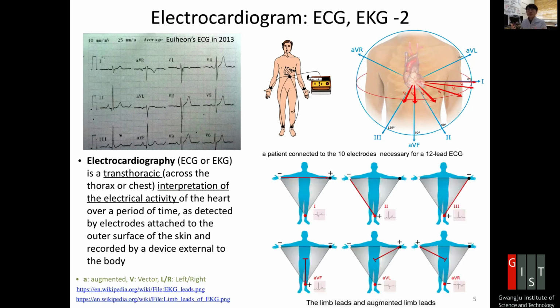So how do we visualize this three-dimensional electrical vector with these 12 electrode leads? A very simple way: we have these two arms. By the way, you have to see these as if the patients are looking at you. So this is the left part. You can consider the two arms and the foot as an inverted triangle. From a vector point of view, you can make it easy. Let's say we subtract the right arm from the left arm. So we can create this vector. Let's name it I.